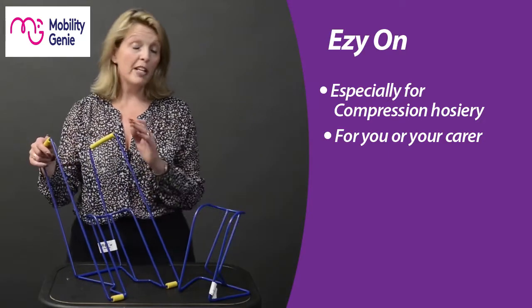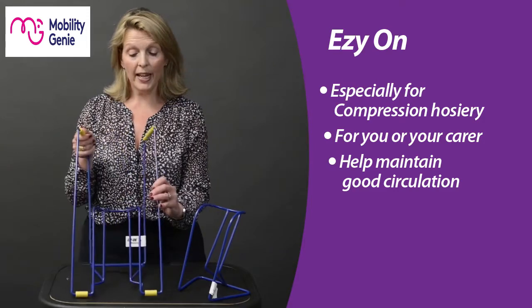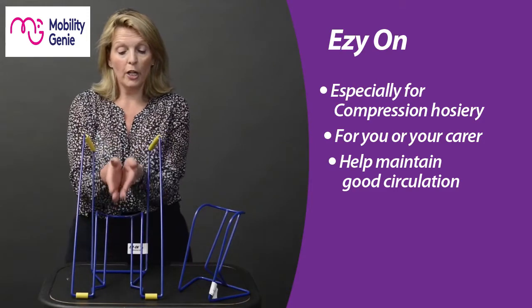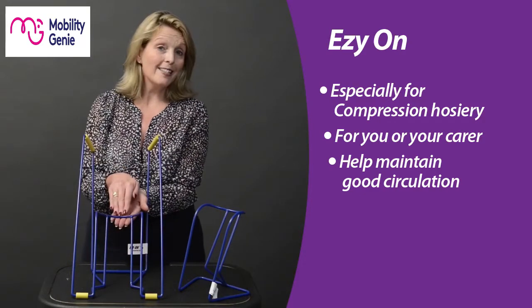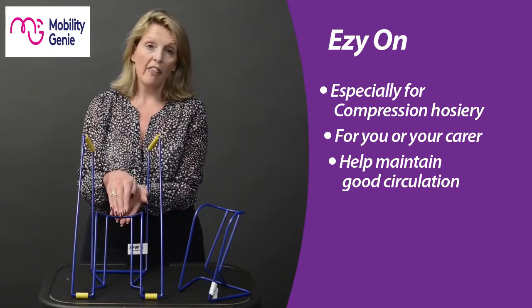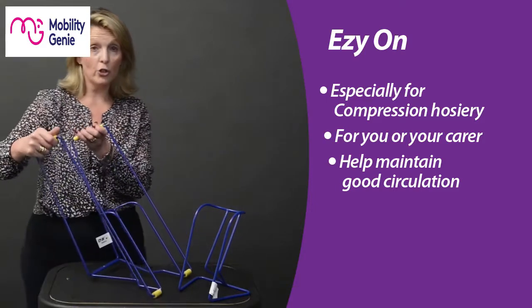If you'd like to manage it yourself from either a seated or a lying position, the Easy On tool works the same way. Load the compression hose and slide it out until it gets to the heel point.